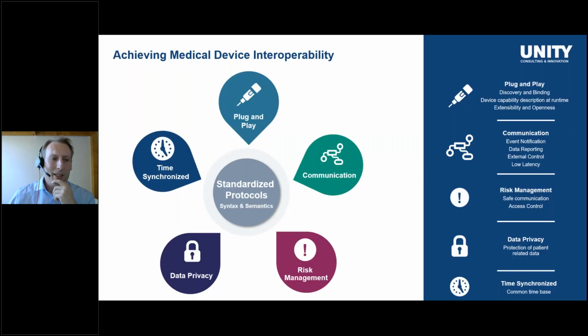Thank you. So I see that there is already a lot of use of interoperability standards, basically from the enterprise world, HL7, IHE. And what I would like to show you now is how I see the interoperability standards landscape from the perspective of a medical device.